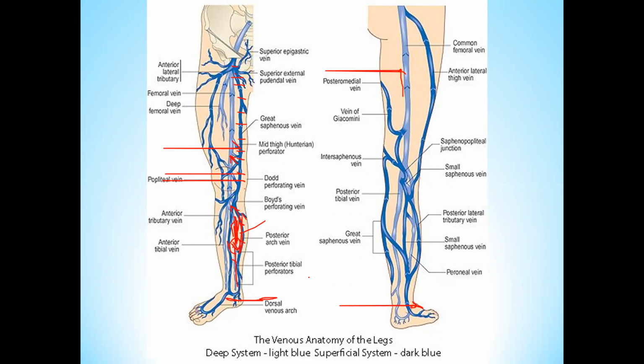Once you localize the peroneal artery, then you can follow it. But anatomically, there is a great deal of variation in the peroneal arteries compared to the posterior tibial artery. That's why the localization of the peroneal artery is a bit difficult as compared to the posterior tibial artery and veins.